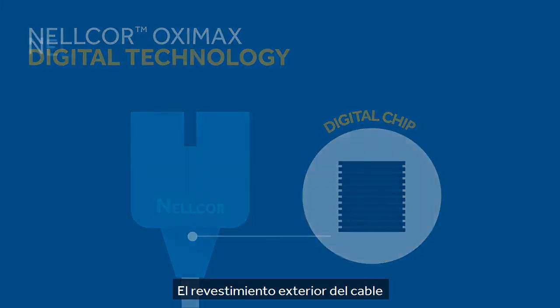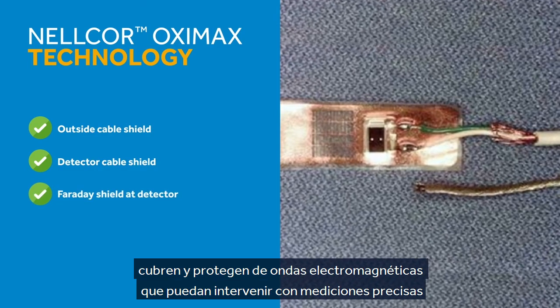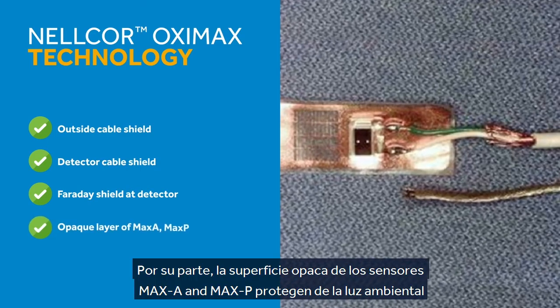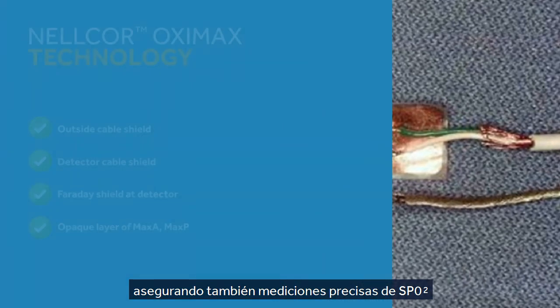The outside cable shield, the detector cable, and the Faraday shield at the detector shield and protect from electromagnetic waves, which can interfere with accurate readings. The opaque layer of Max-A and Max-P protect from ambient light, which also ensures accurate SpO2 measurements.